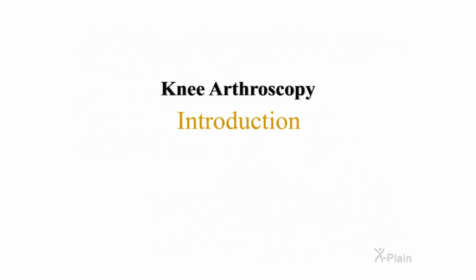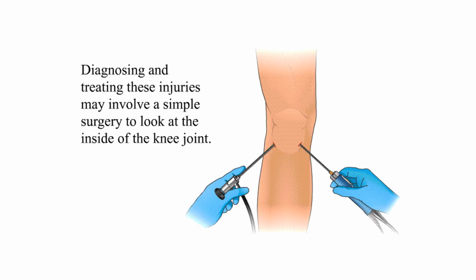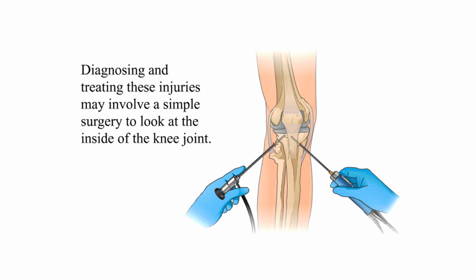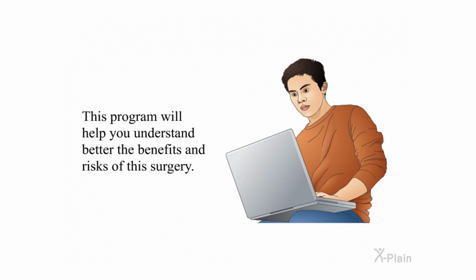Knee Arthroscopy Introduction. Over the last few years, knee injuries have become common because people are exercising more frequently. Diagnosing and treating these injuries may involve a simple surgery to look at the inside of the knee joint. If your doctor recommends knee arthroscopy, the decision whether or not to have the surgery is also yours. This program will help you understand better the benefits and risks of this surgery.